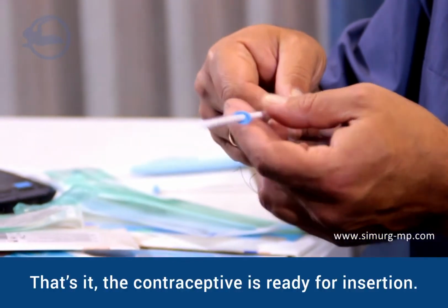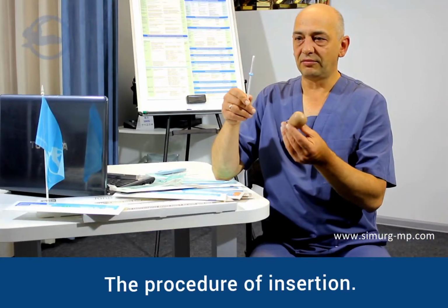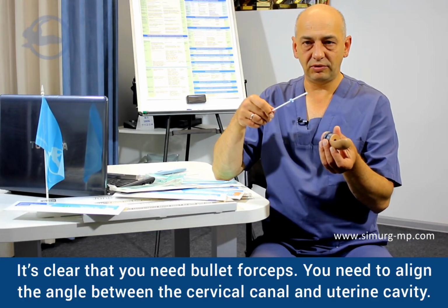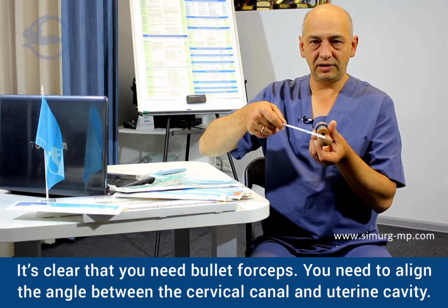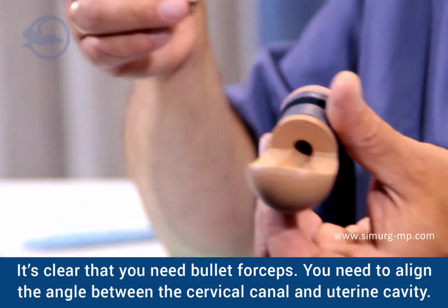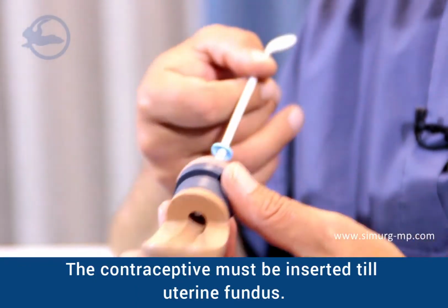That's the contraceptive ready for insertion. The procedure of insertion: it's clear that you need bullet forceps. You need to align the angle between the cervical canal and the uterine cavity. The contraceptive must be inserted till the uterine fundus.